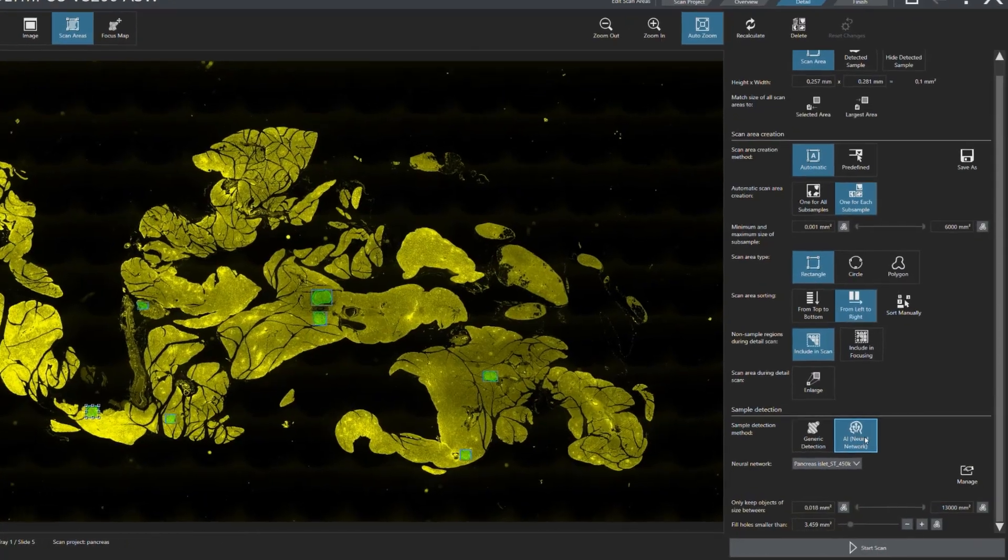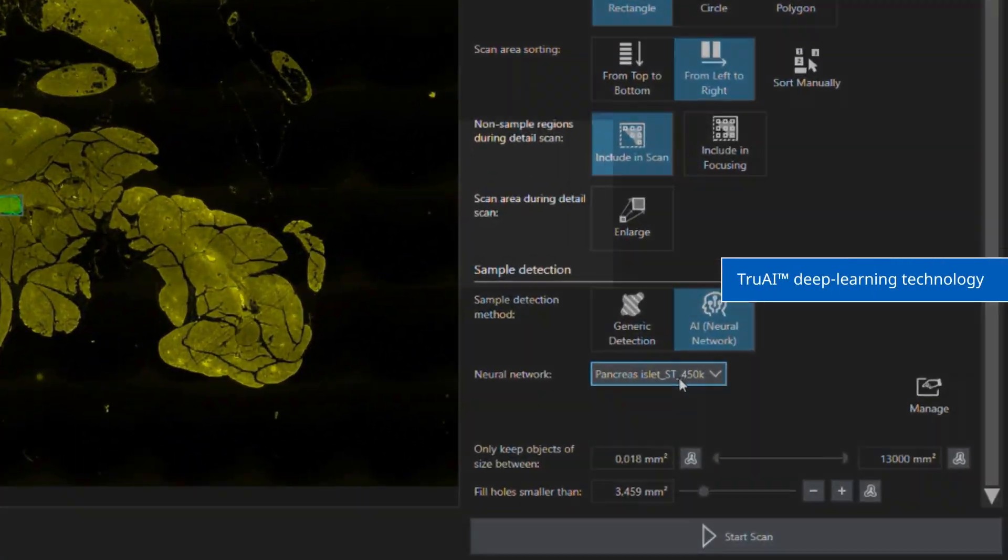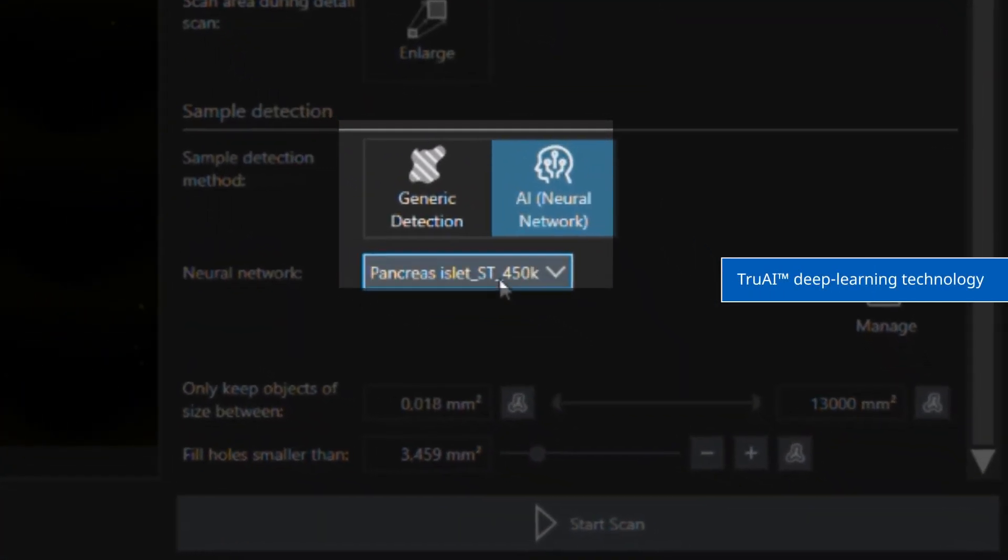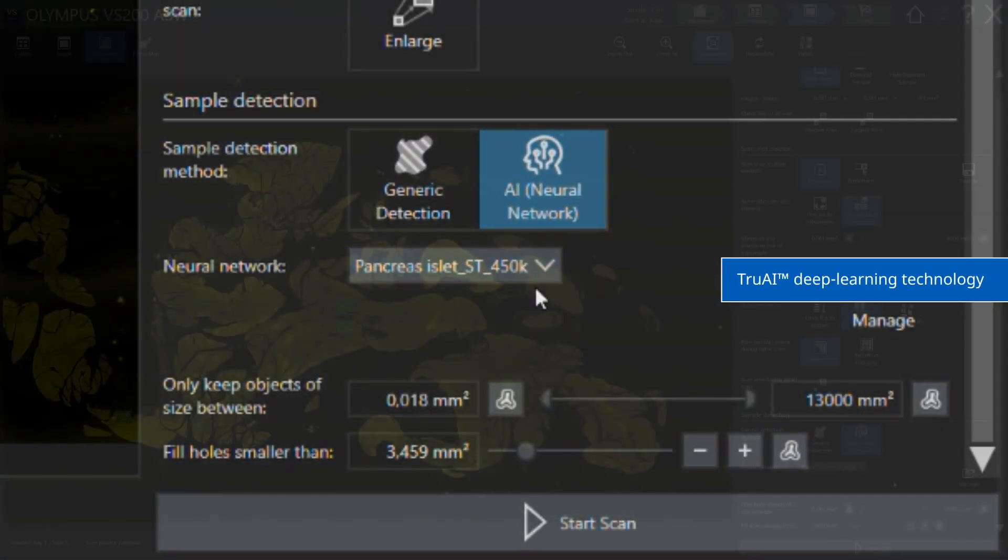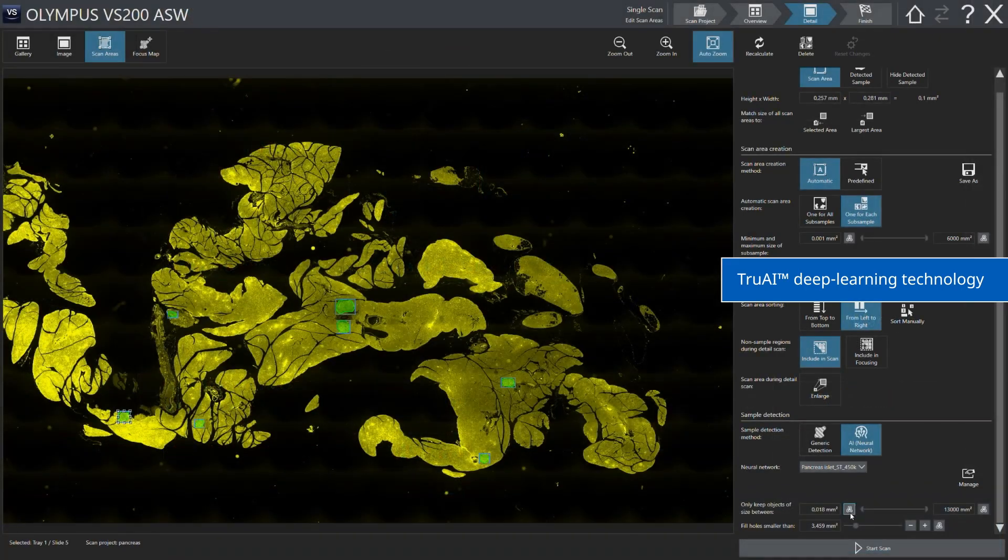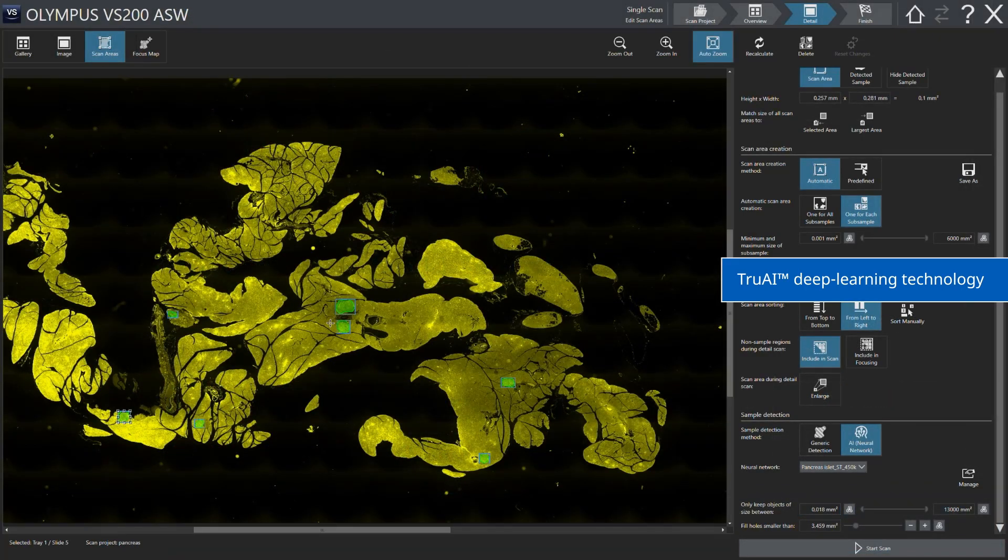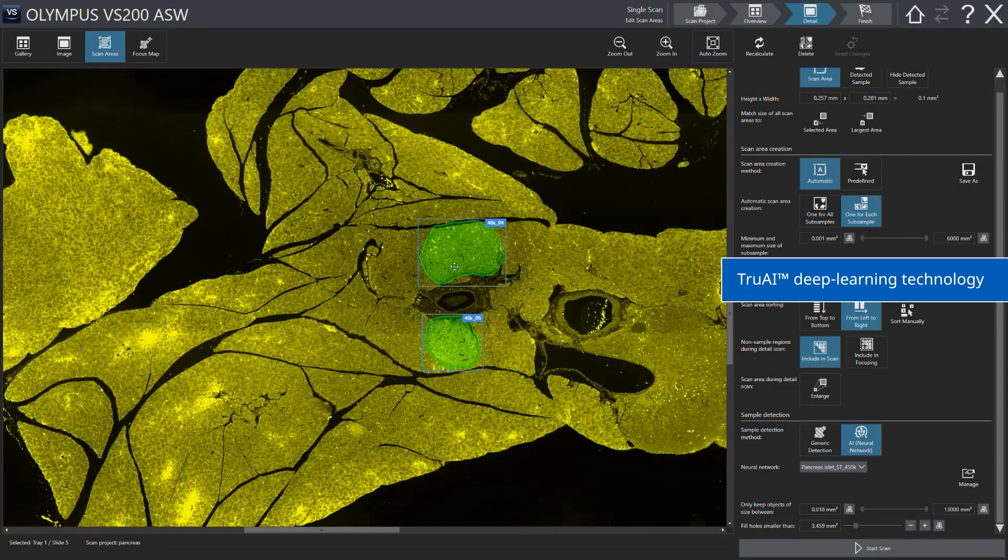True AI Deep Learning Technology further advances automation with improved sample detection accuracy and selective scanning based on morphology.